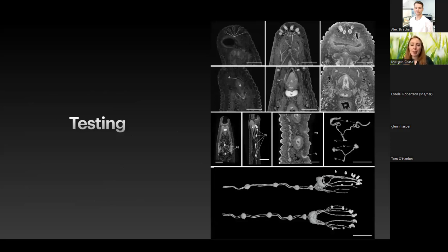So the comparison of the 3 different stains we used are indicated on the right here. So as you can see, the stains attach to different tissues in very different ways. On the left, I think that was the PTA, if I remember correctly. Nothing is quite as bright or differentiated as the other 2. And so, it's partly a brightness issue, but you can see, compared to the one on the right, there's an enormous difference in each of them.